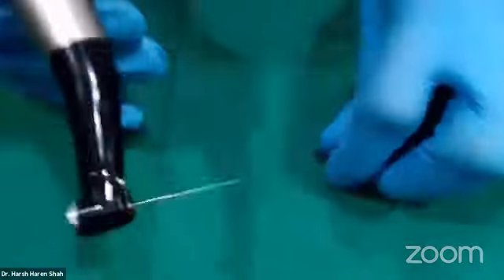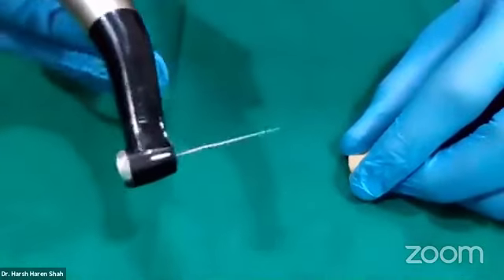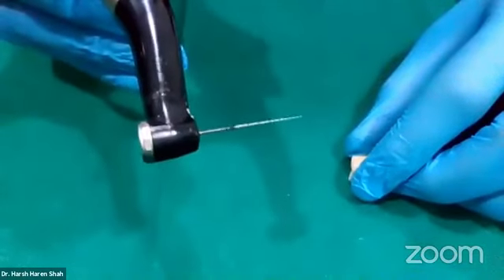So I've connected the 1G to my endomotor. I've set the speed and torque. You can see the file is in rotation. What you do here is, you can do this directly after a 10 number file.